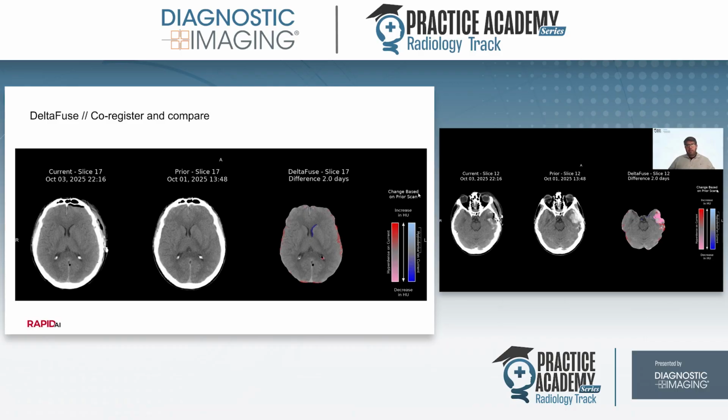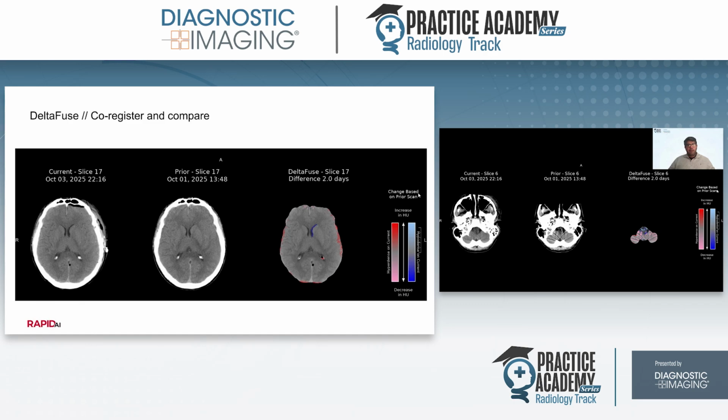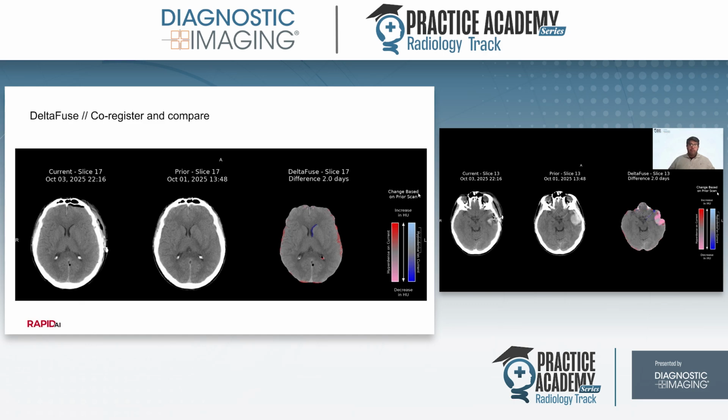So you're seeing that there's light pink color here that's indicative of hyperdensity being reduced. So again, it makes life much easier. The fact that it co-registers and aligns at the same level is extremely helpful in itself.